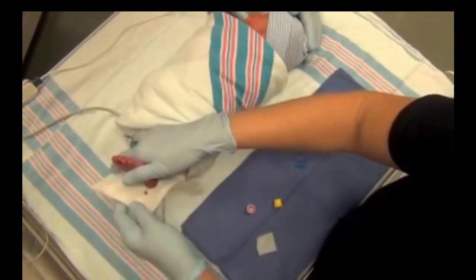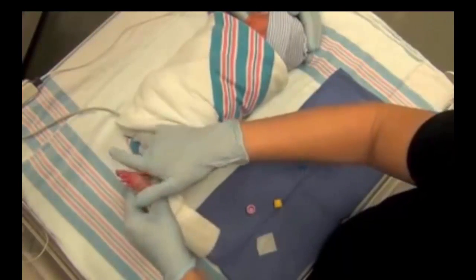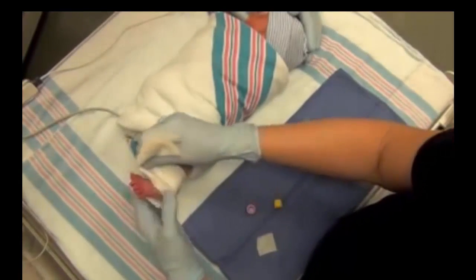When the capillary sampling is complete, tamponade the puncture site and wrap with gauze or an adhesive bandage.